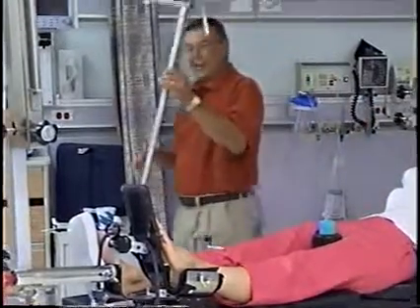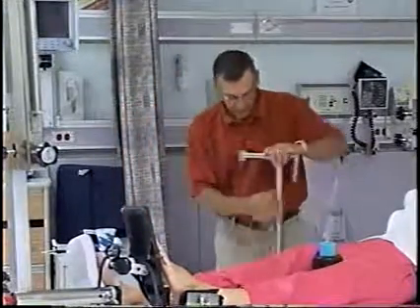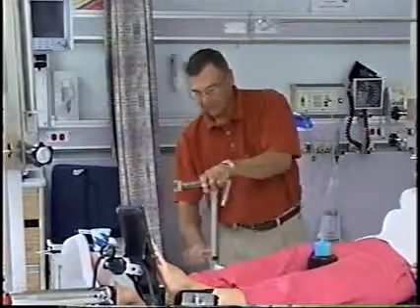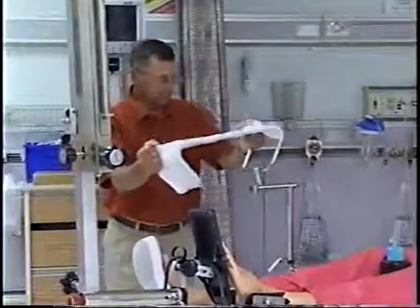This is called a well leg support. It simply drops into here. All right. Now we can move this bracket just about any direction we wish. And into that, we're going to attach this well leg basket.